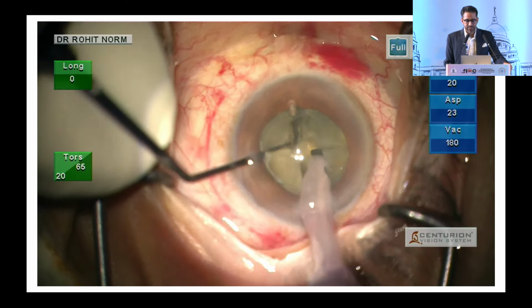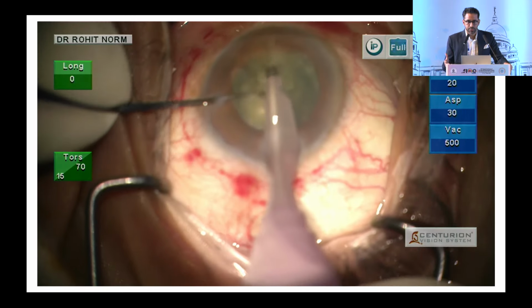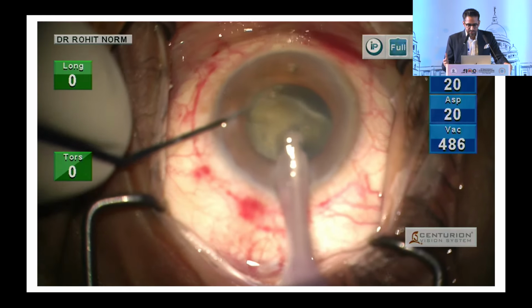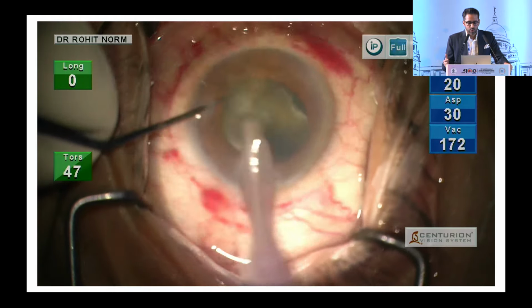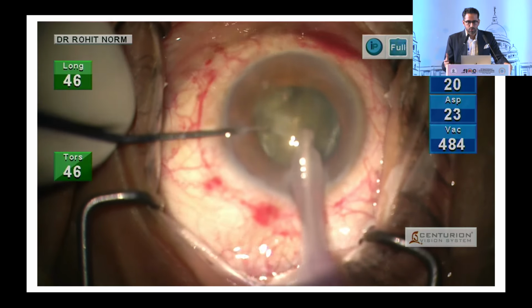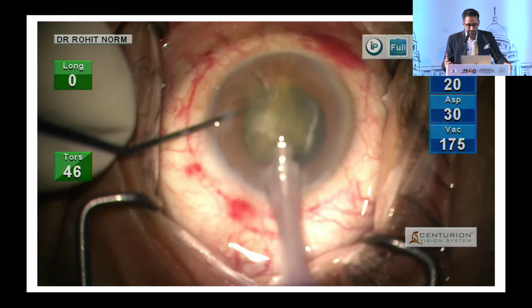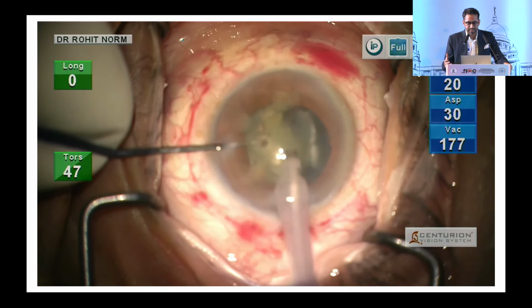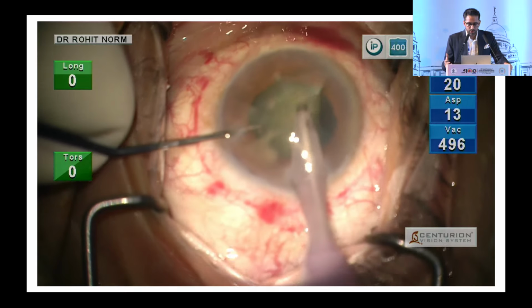So advantages are that, as I told you, the aim is to have a minimal pressure difference between the anterior and posterior segment so that these nuclear pieces will just float in the anterior chamber without pushing back. So there is no undue deepening of the anterior chamber, no posterior extension of the defect. Minimal infusion of fluid prevents any vitreous hydration or vitreous drawing to the tip.